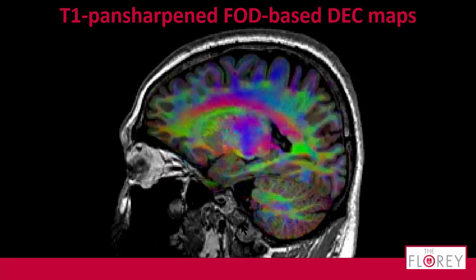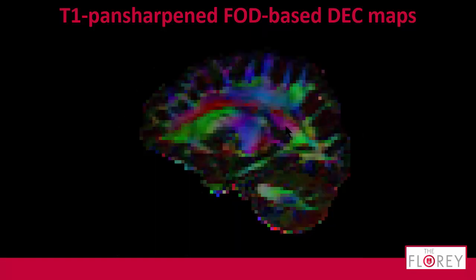So here we are again. Let's observe, oh yeah, well, cerebellum, also some nice details. Again, that corpus callosum, nicely interdigitating. And if after a while you do get confused, like, is this red brighter than that blue or than that green? And I still want to see my T1 intensities, I can simply switch back. And it's not as offensive. I mean, the context is still there. Certainly beats switching back to this ugly one that we want to get rid of. So basically, here you see that the corpus callosum is simply broken, and I don't know if that's even still a cerebellum or a very big disease.